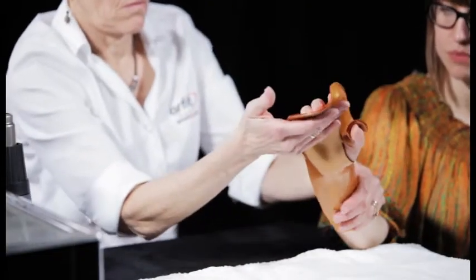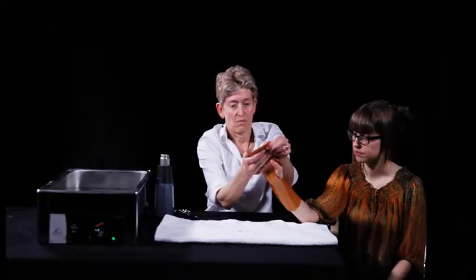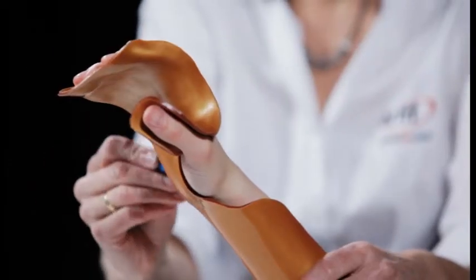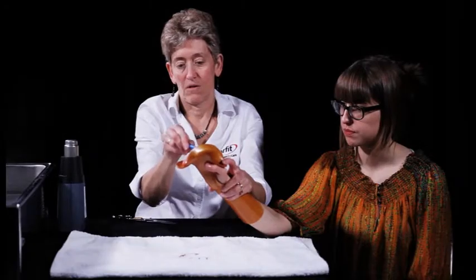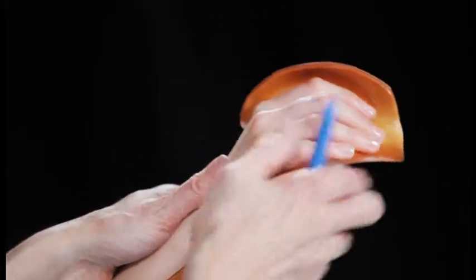Flip the patient's hand into pronation to check the alignment on the dorsal side. Let the material harden in the desired position. Mark the trimming edges along the borders of the orthosis. This can be done both inside and outside the orthosis.